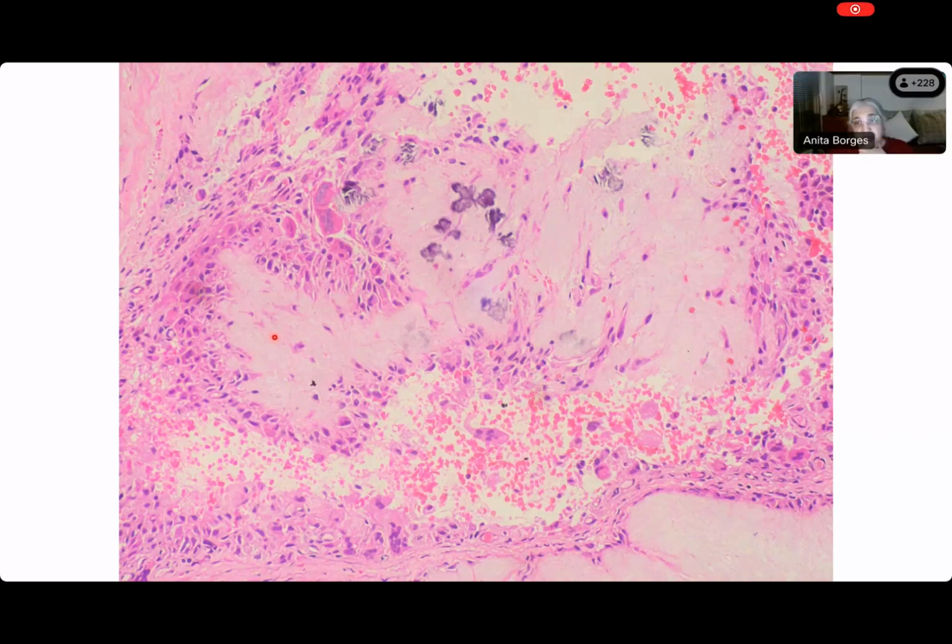Prayas, I do not see mixed inflammatory cells. And you know, if there's one thing that irritates me, I have a lot of patience, but it is mixed inflammatory cell that irritates me. Lymphoplasmacytoid cell is another thing that irritates me, because very often these words are used in a lazy kind of way. There are no mixed inflammatory cells here. There are only histiocytes. And some of them have an epithelioid character. So I wouldn't object to somebody calling this an epithelioid type of histiocyte.